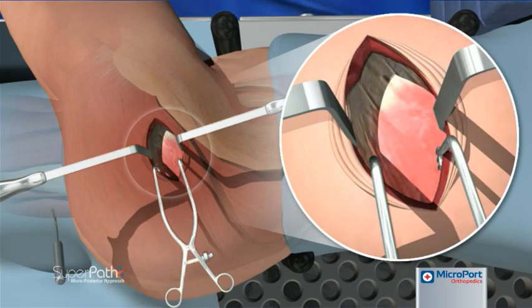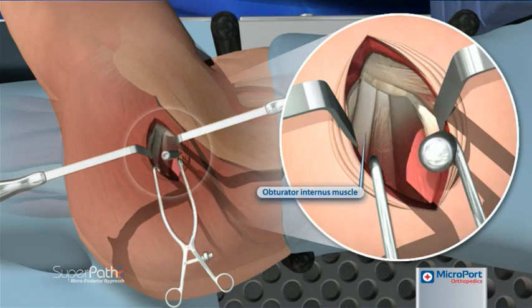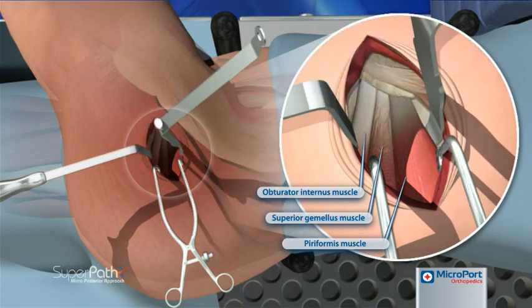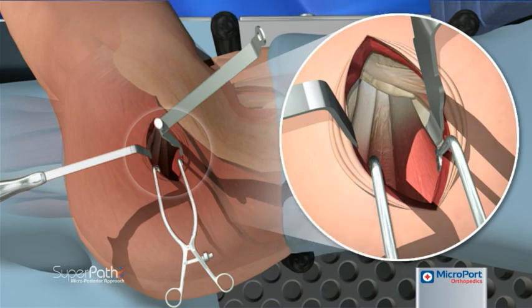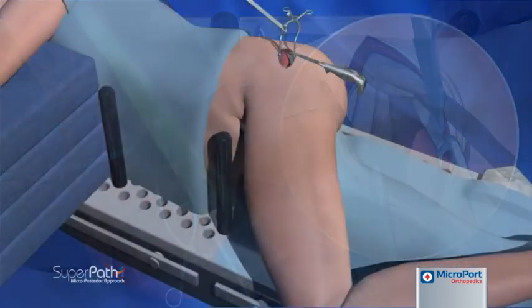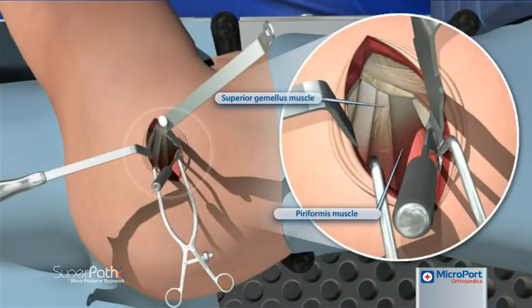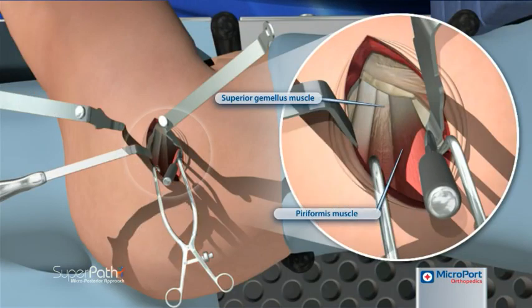After careful incision of a very thin layer of the bursa tissue, a cob elevator is placed under the gluteus medius. The cob elevator is then replaced with a blunt Hohmann retractor, using gentle pressure to maintain the position in the interval between the gluteus medius and the gluteus minimus. With the hip abducted and externally rotated, a cob elevator is placed between the piriformis tendon and the gluteus minimus.